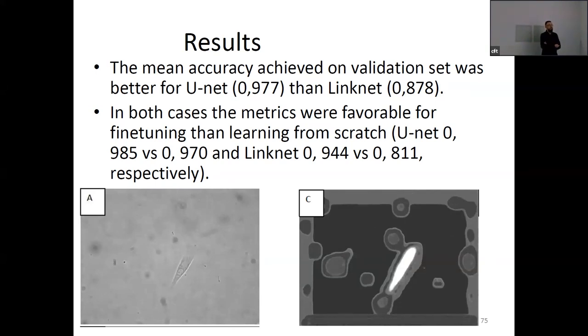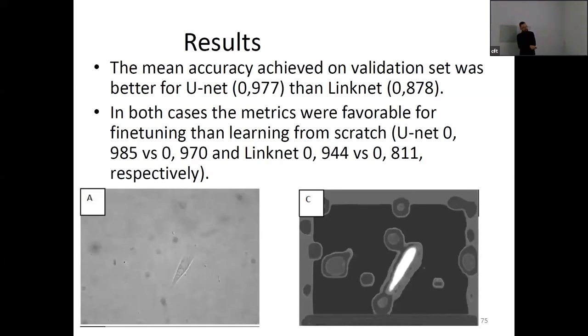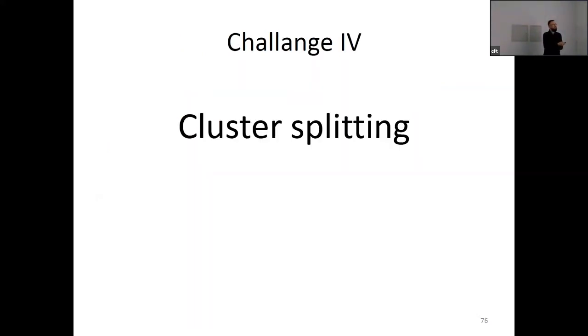So as you can see, there are some pros for deep learning, even for what seems quite an obvious approach for machine vision. It could be most easily done with some thresholding algorithm, but it was easier to actually establish a good deep learning method. Of course, the downside of this approach was that we had to establish a big data set for that. Somebody had to sit through a lot of images and mark them with the boundaries.